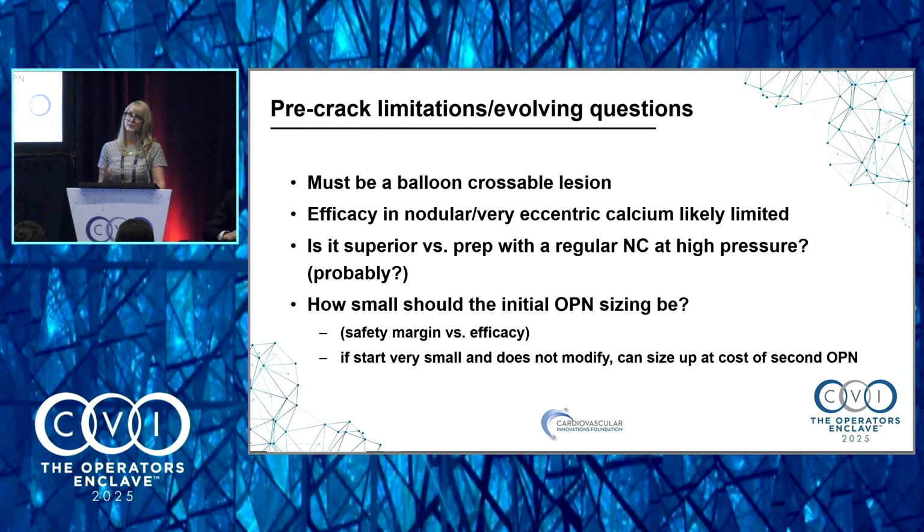Some limitations or potentially evolving questions. It has to be a balloon-crossable lesion, of course, otherwise you'll have to do ROTA or something else. The efficacy of this technique in nodular eccentric calcium, I would say, is probably more limited. So in that instance, I might go towards something else.